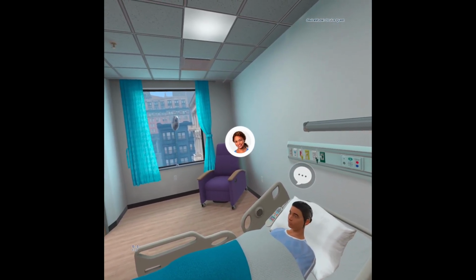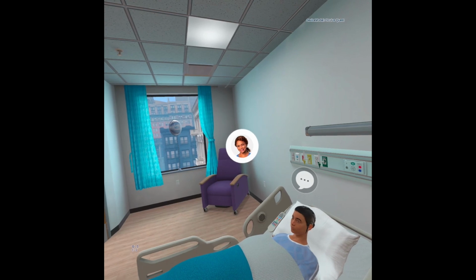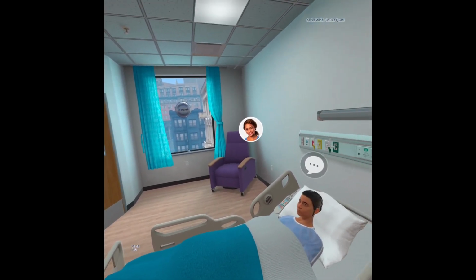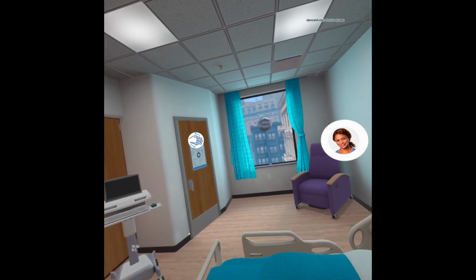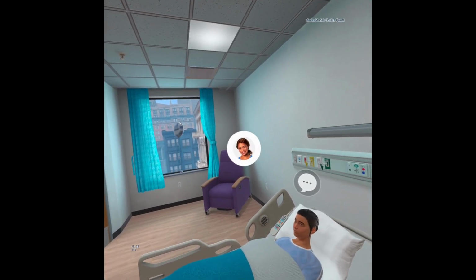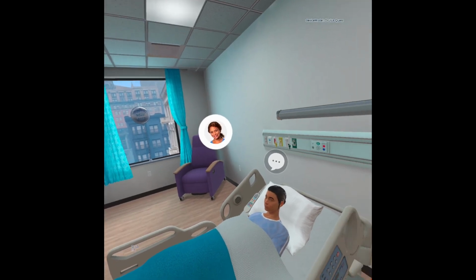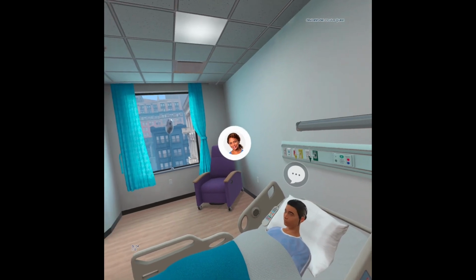I need your help transferring our patient Heather from the bed to a wheelchair using a gait belt. I confirmed her identity and explained the procedure, and she gave consent for us to continue. What happens first? For this procedure, we'll need a gait belt, non-slip socks, and a blanket. We do not need an alarm and pad for Heather. What must you do for patient privacy? Show me what to do now.